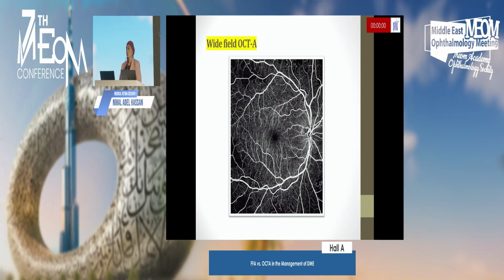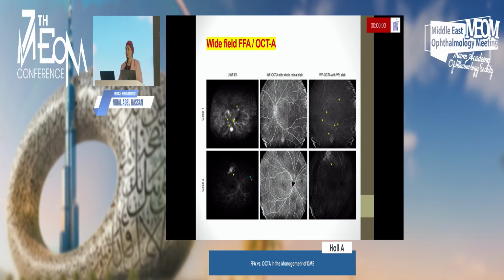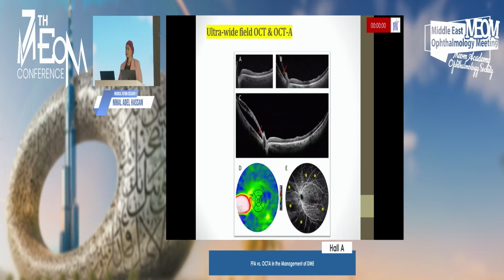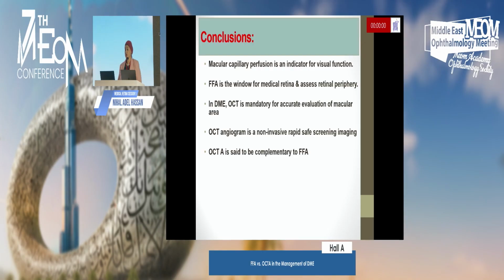But comes the wide field OCT angio, where we can take the 12x12 and even the whole posterior pole, and the new technology with the rapid speed of the swept source and even the spectral domain OCT in some apparatuses might allow us to have a definite wide view assessment without dye injection. That might help a lot in our practice, for those fearing giving dye injection.